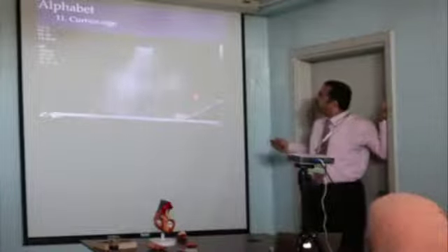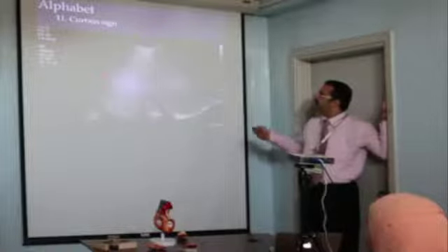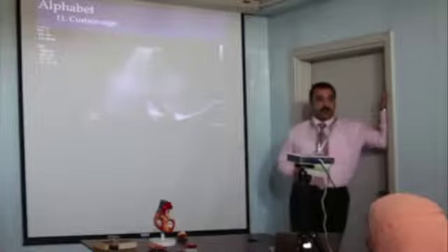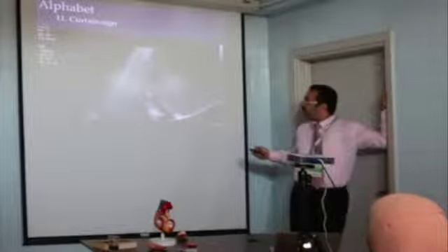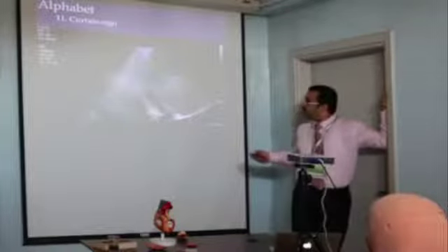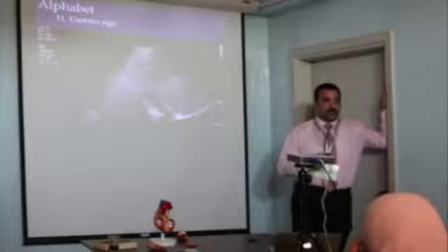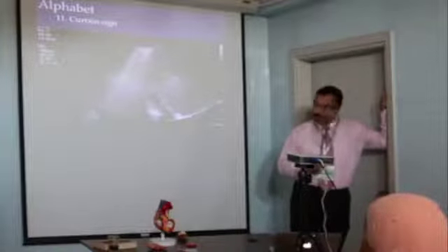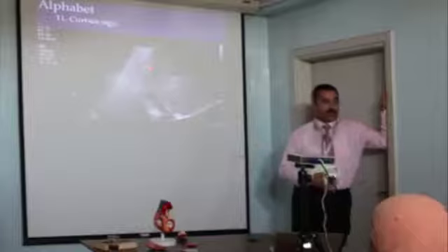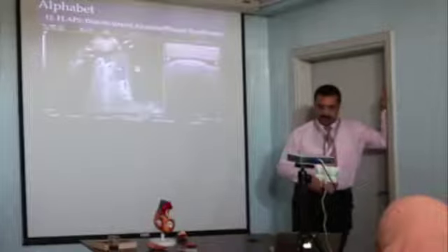This is the liver, and when the patient takes inspiration, some B lines are coming and covering this area. Curtain sign, usually normal. But if underneath you find some effusion or collapse, that's not normal. So the curtain sign itself alone is indicative of normal lung. But with this one, there are multiple B lines, so this patient may have some edema or pneumonia.